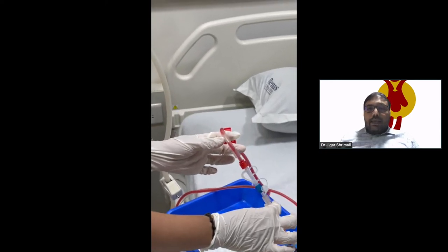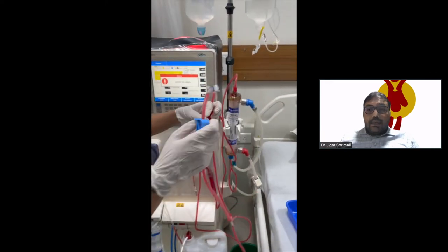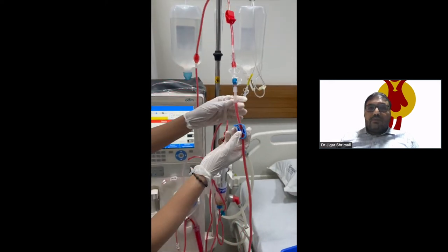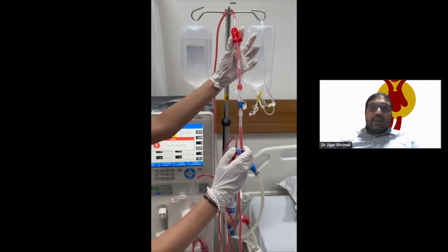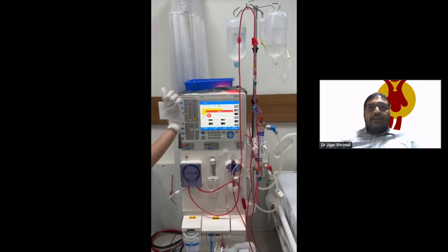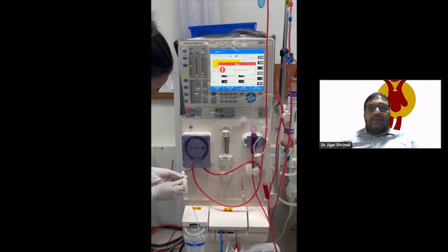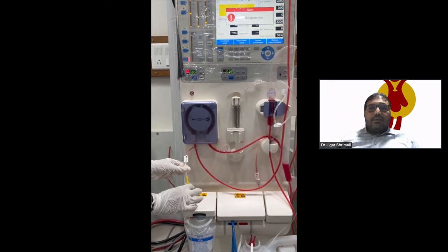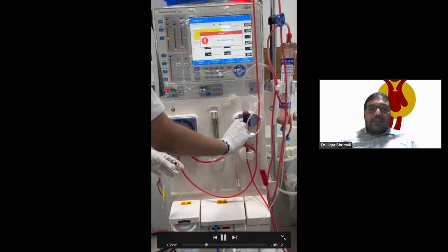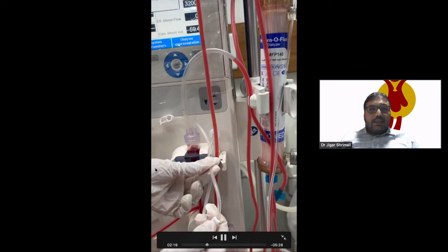We do not connect the patient during air removal, because if the air enters the patient, the air embolism we discussed in the previous blog will cause a medical emergency. So we put the circuit into recirculation, then open the two clamps — like the patient dialysis arterial and venous end situation is created. After that, we connect the saline with the arterial infusion set line.